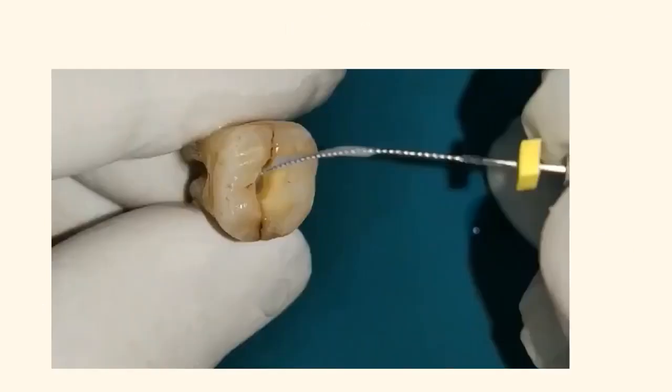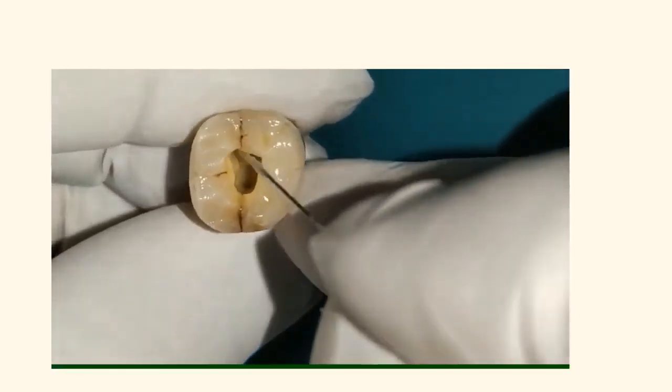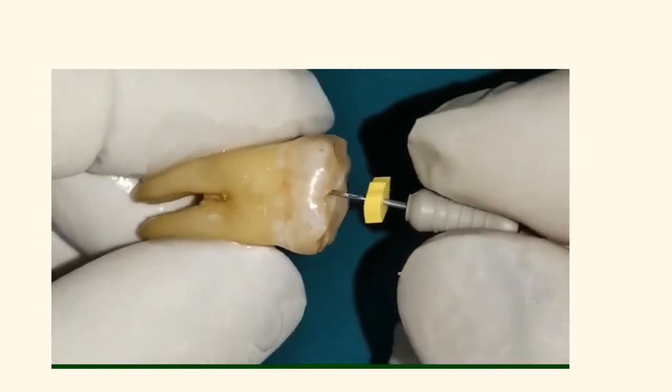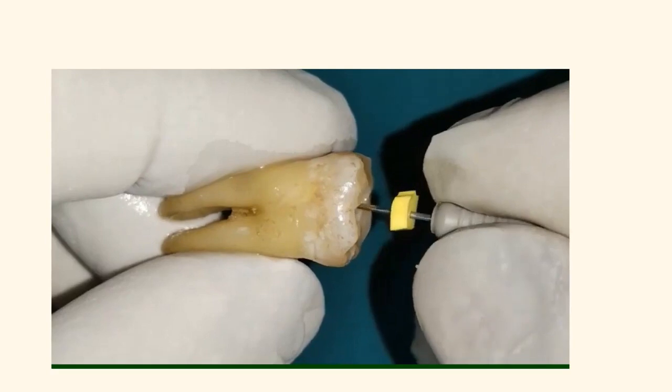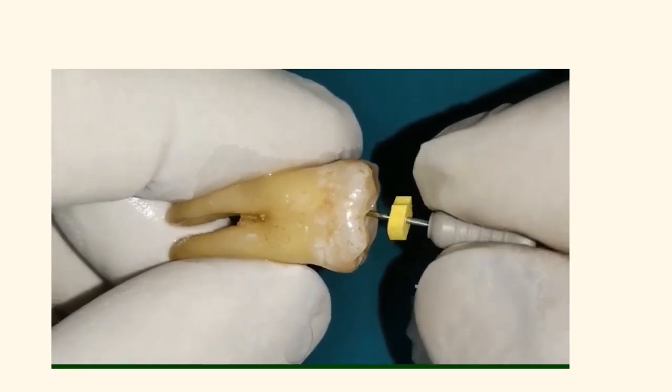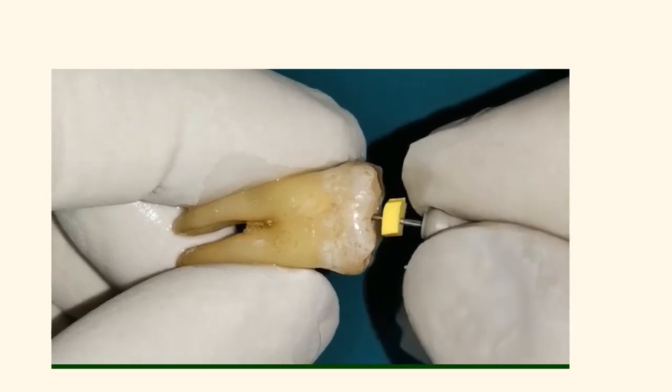This is a small video showing the procedure of following the canal to the radiographic terminus. The chamber must be generously irrigated with sodium hypochlorite. Then a number 8 or number 10 K pre-curved file coated with EDTA is passively and very gently introduced into the canal without forcing or pushing it. This initial instrument requires only watch winding motion. This is always a safer way to advance a file down into the canal.